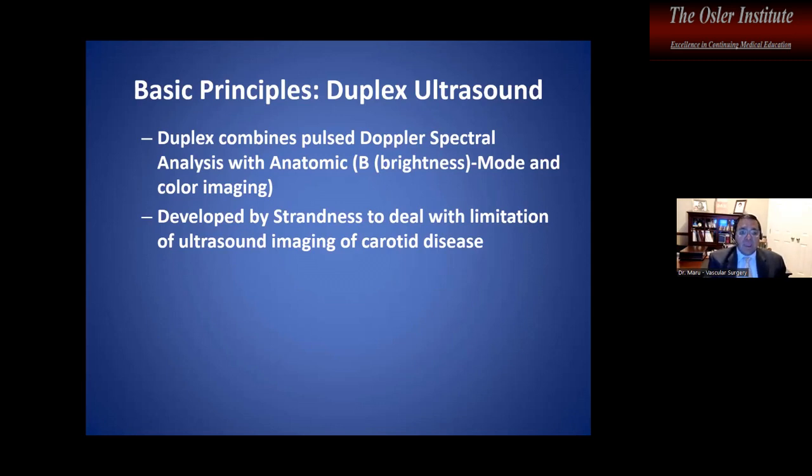In this day and age, when we do a lower extremity exam, nowadays you may do a spot ABI down at the ankle or the toe, but a duplex ultrasound will give you a lot of anatomic information as well. It's important to combine the two, especially if you are doing a surveillance follow-up for a stent or something like that. You've got that ultrasound information that will give you a lot of little details that'll help you prevent shutdown. So if you stay on top of it, it's critically important.